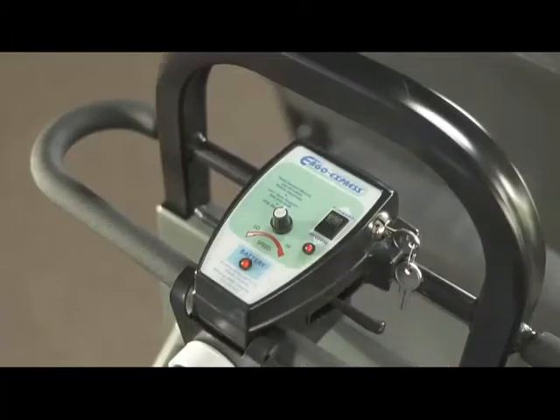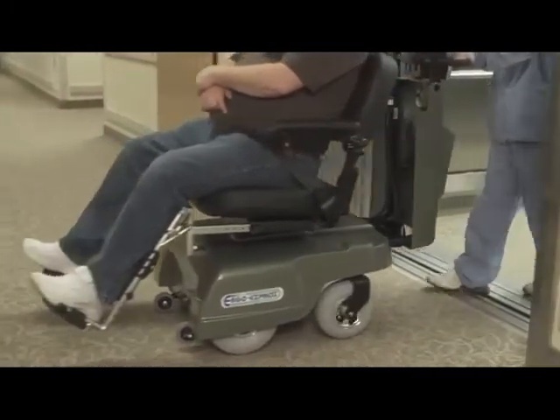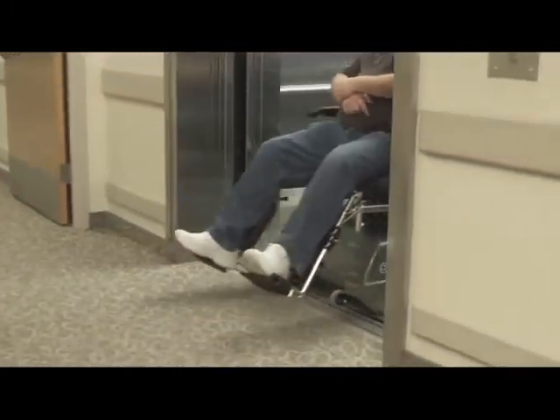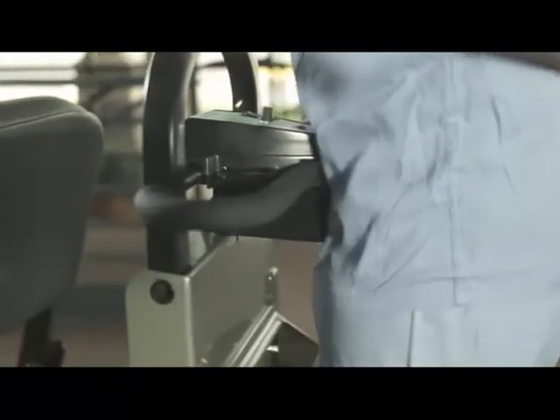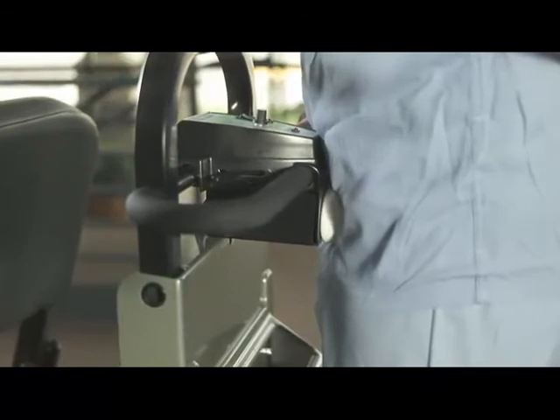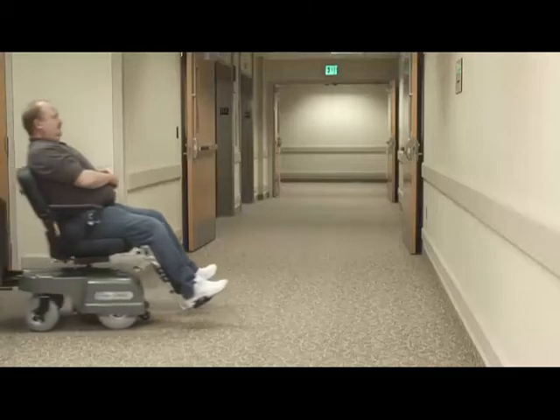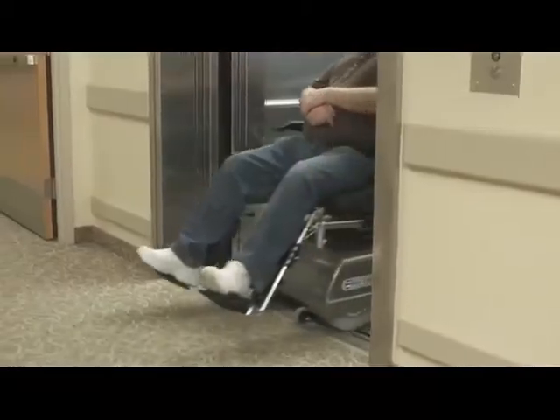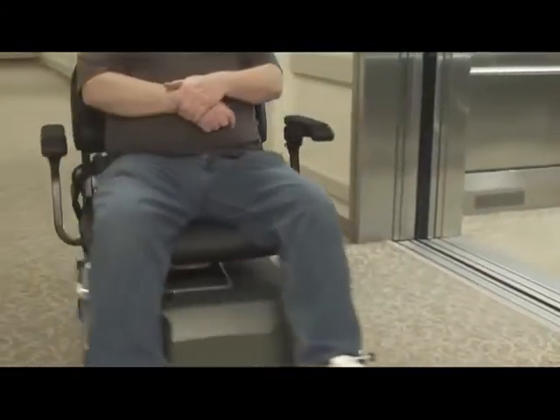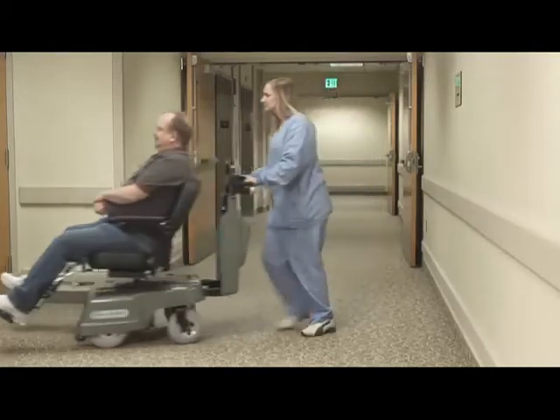Stop the PTC and press the reverse button. The reverse indicator light will illuminate. Drive the PTC in the reverse direction with one hand on the controller. Be careful in reverse when operating with a patient. While the PTC is moving in either direction, engaging the belly bump switch immediately and abruptly stops the PTC. Perform a few starts and stops to become familiar with the throttle lever. When cornering, your control increases when you release the throttle lever slightly and go slower.